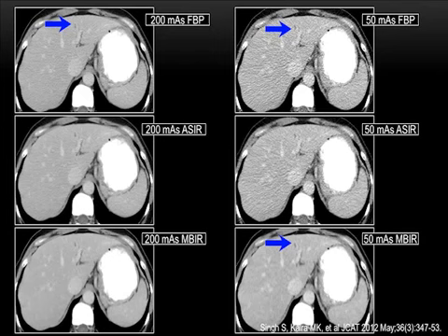So now there are different terms used to point out this texture, which is a different look, a plasticky look, a blotchy look, or they'll just call it a different look, even though I see the noise. If you ask a specific question, is the noise gone down? Yes, noise has gone down. Can you see a tiny lesion? I can still detect a tiny lesion, but we cannot call it the same as this one.